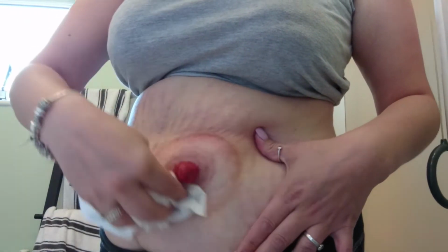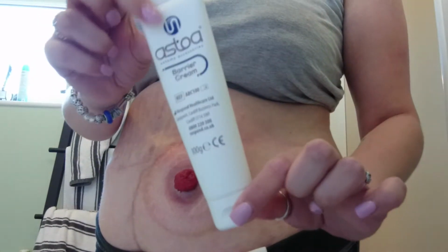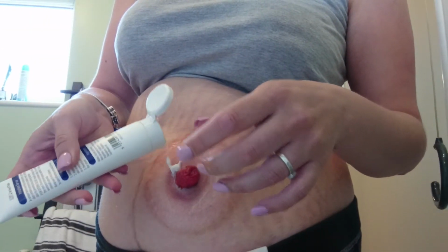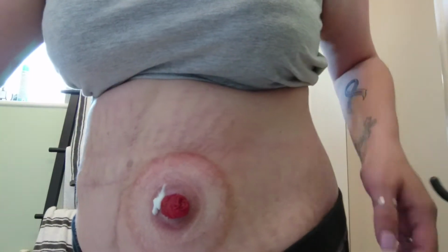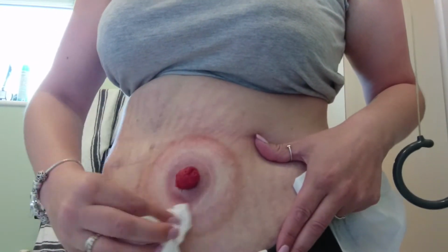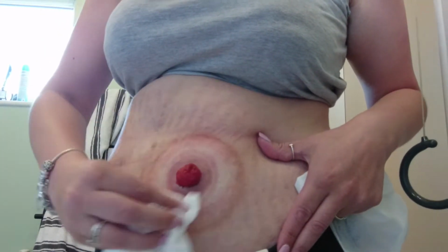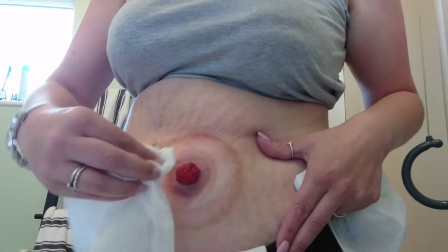So do that, and then I've got my barrier cream, which is that one, which I use just to protect my skin. Since I've been using the barrier rings, I no longer have to use the barrier powder as a crusting method, so that's brilliant. So I just give that a wipe round there. This stuff dries really quickly. It's just a matter of about 10 seconds and it's done, it's dusted and it's dry. So I've put that round, massage it in, it's all done.